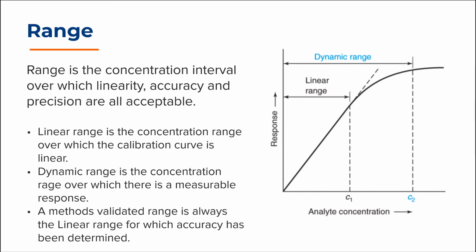By contrast, the dynamic range is the range of concentrations over which there is a measurable response. Here again, the dynamic range is highlighted in the figure in this slide.